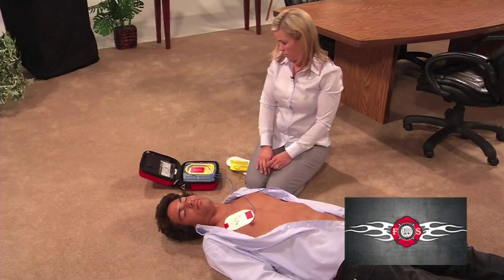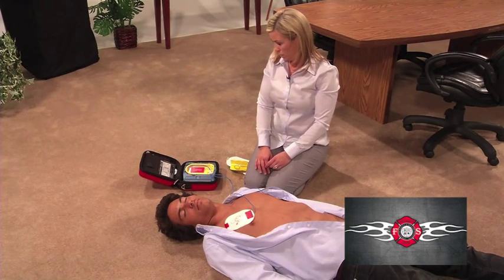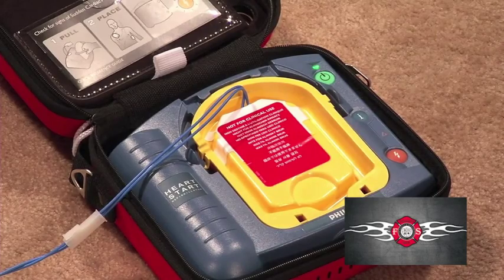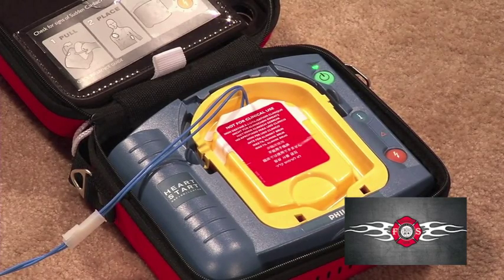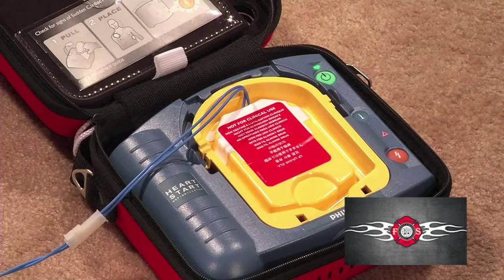As soon as the pads are in place, the AED will immediately start to evaluate the heart rhythm. Make sure no one is touching the patient, then press the flashing orange button now.